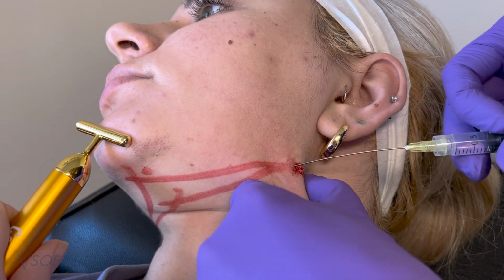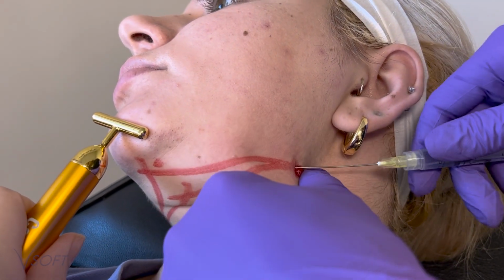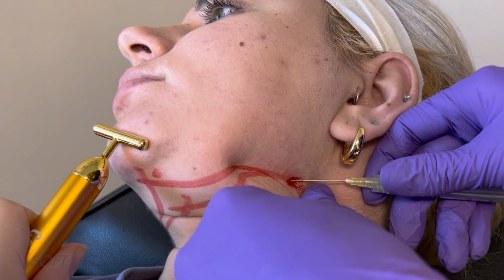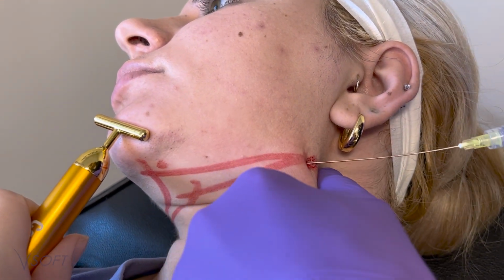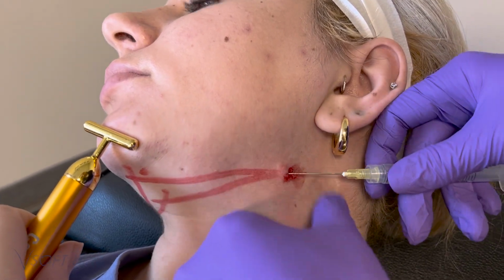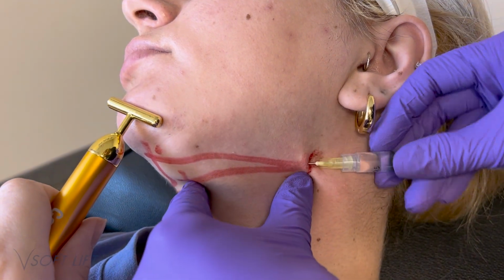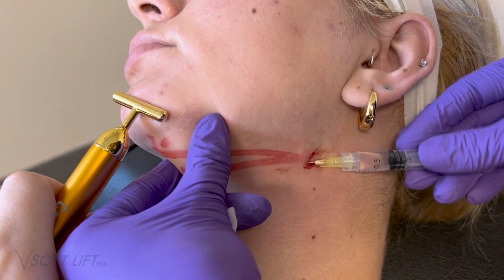So just moving along, I worked on marking her up when she was sitting upright, always, just so I know what I want it to look like and how to pull. It's interesting seeing the patient from this angle because you never know if they're closing their eyes or keeping them open. Her eyes were open this whole time, but you can see she's not even moving. She was very comfortable. I numbed the porthole and then I created the porthole with an 18 gauge.